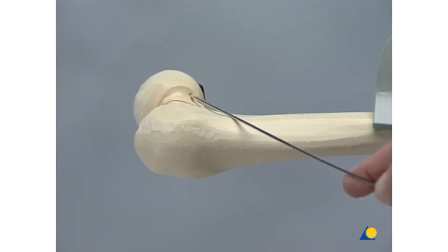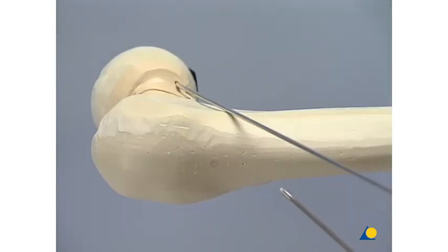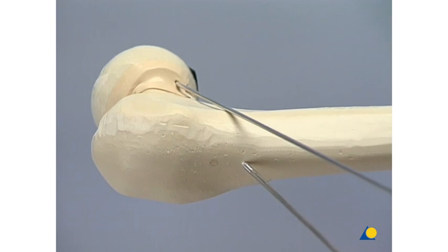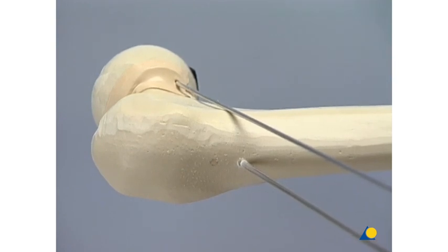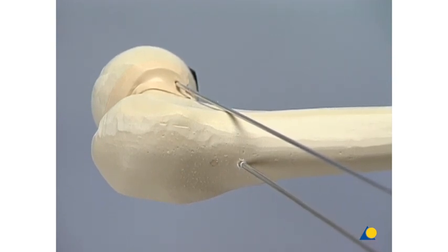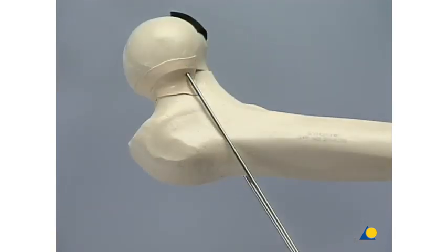The first 2.8 millimeter guide wire is introduced parallel to the orientation wire and its position is checked under fluoroscopy. If the first wire in the head and neck is correctly positioned, the orientation wire may be removed.